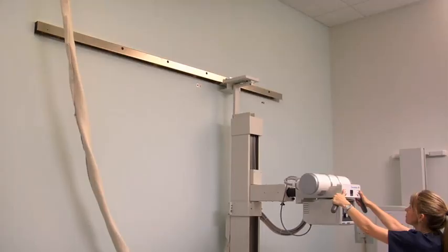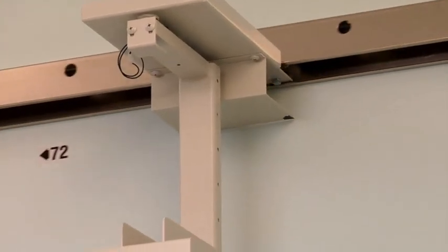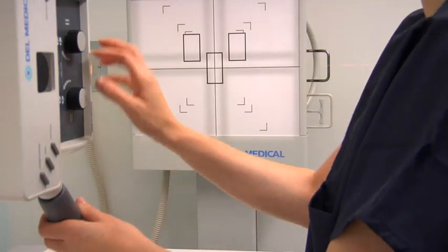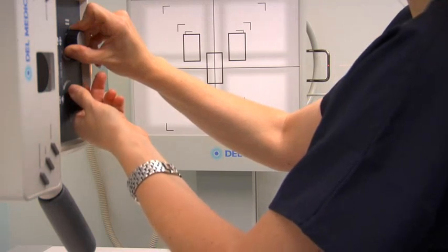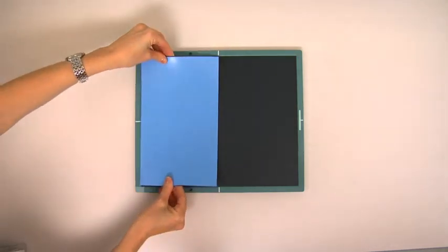Set the source to image receptor distance, SID, which is usually either 40 inches or 72 inches. Turn on the collimation light. Align the central ray to the image receptor and collimate to the size and orientation of the cassette being used. If using a single cassette for multiple projections, divide it into sections with a lead blocker.